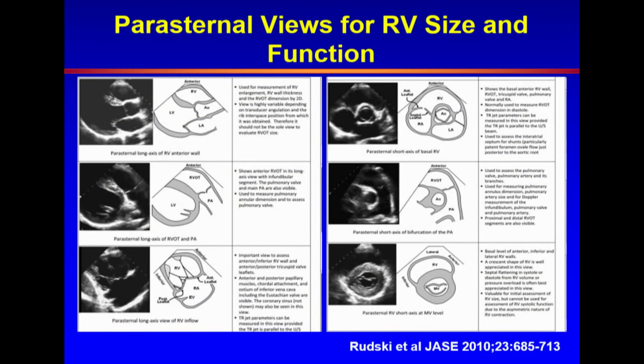In echocardiography, we have 2D and we have 3D. 3D is making its way still, so we depend a lot on 2D, which means you want to image the RV in multiple views and then put things together. Not infrequently, because our techniques and our planes are not perfect and not necessarily the same for every patient and not necessarily the same when different sonographers tackle the same patient, one has to put things together from the different views before reaching a conclusion. It is not looking at one view and then making a determination.